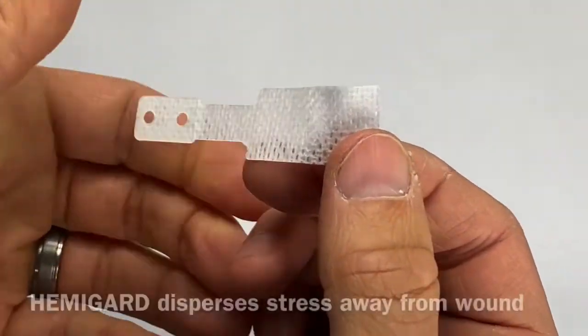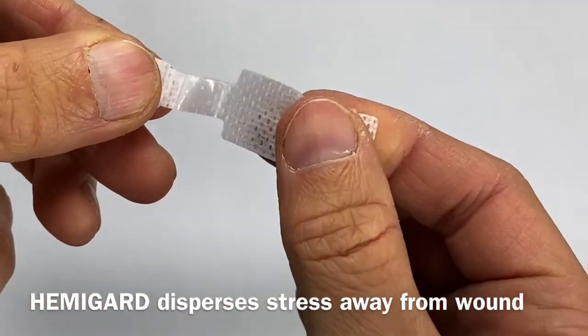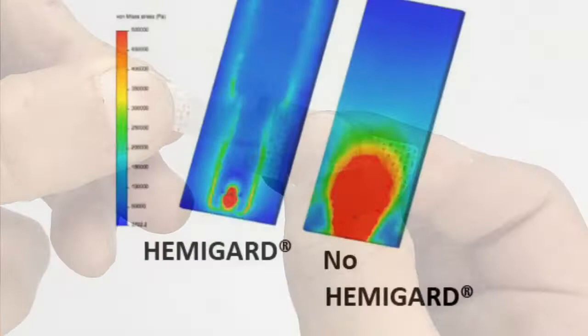The top portion that's water-resistant is also quite stiff, and this helps disperse the stress of the wound closure away from the wound edge, which is very advantageous, as you can see in this finite element analysis.